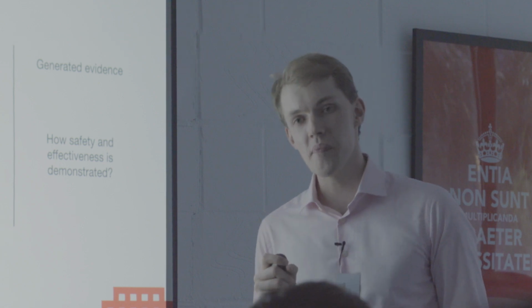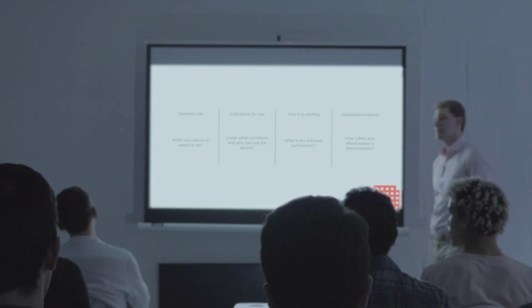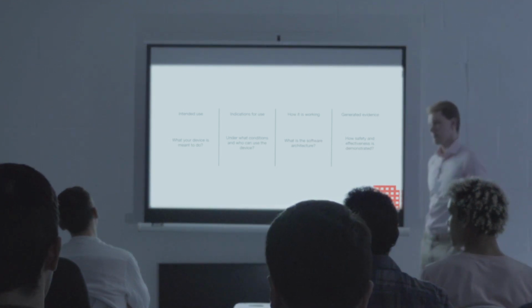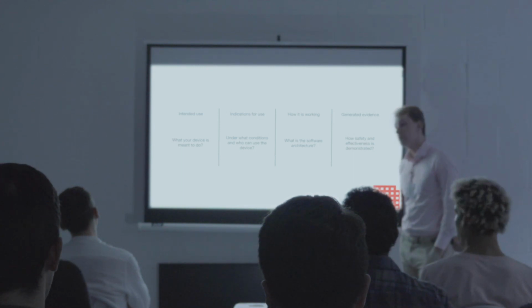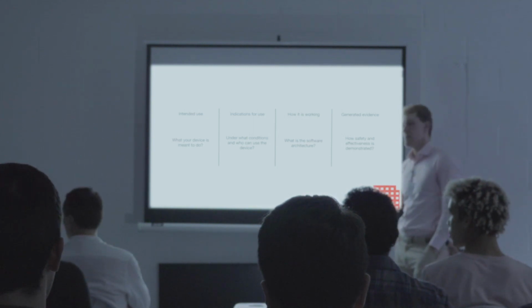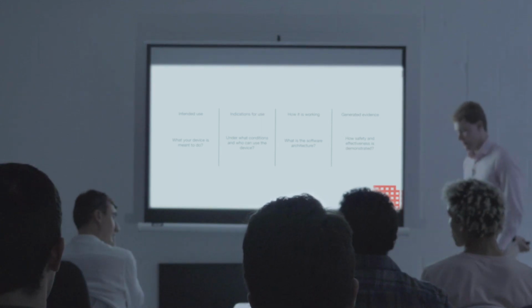Can I add something? I don't know if you can answer for Parkinson's, for example. I think for Parkinson's, the gold standard is a subjective score from a physician that gives basically the amplitude of the tremor, and that's basically the gold standard metric. Are you doing a comparison against those types of subjective gold standards? I'd like to know a little about the experience of that comparison.